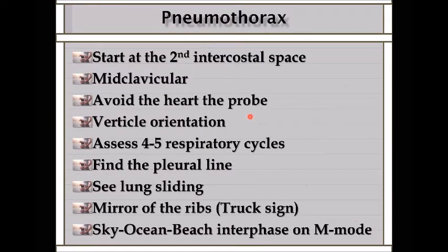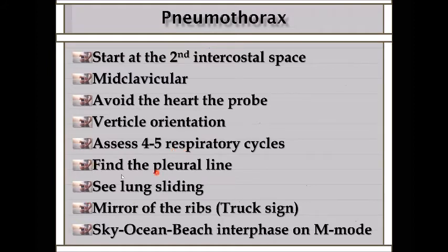To diagnose pneumothorax by ultrasound, start at the second intercostal space at the mid-clavicular area. If on the left side, avoid the heart. Always hold the probe vertical to the ribs, wait for 4 to 5 respiratory cycles, and look at the pleural line. Then assess sliding and look for the mirror image of the ribs (track sign). We will also look at the sky-ocean-beach interface on M-mode to diagnose pneumothorax.